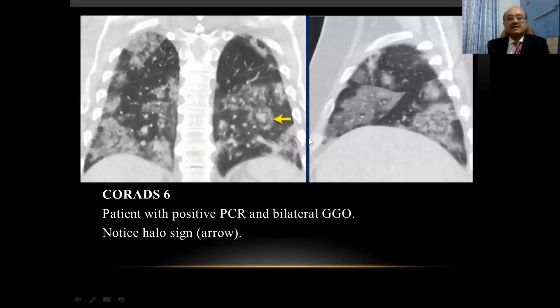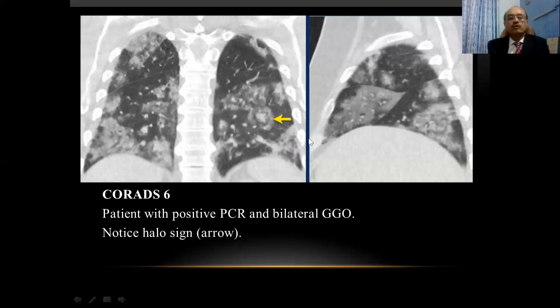CORADS 6 shows typical classical CORADS 5 findings plus a positive PCR for COVID-19. This CT shows bilateral extensive ground glass opacities with a positive PCR. Of note is another important sign in extensive COVID-19: the presence of a halo sign, which is a very important sign of extensive COVID infection.